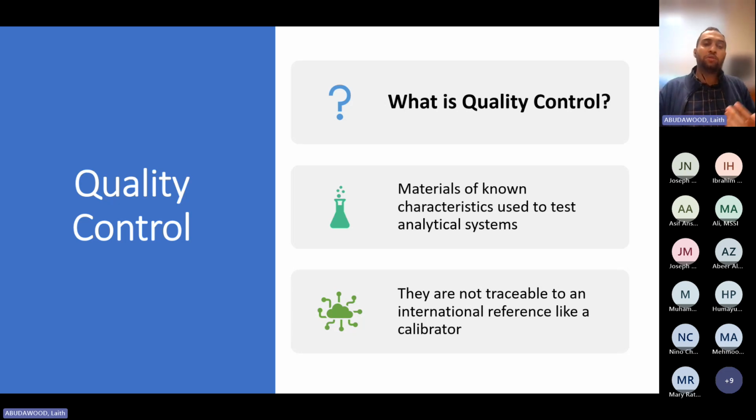Now, one important point: QCs, for example in a Stago case, are generally human plasma. It's plasma collected from donors. But we just said that we cannot use patient plasma. The difference between a QC that is sold to the customer and the patient plasma is this: when I take the plasma that I collected from donors, we take it to a QC department within Stago. The QC department runs this plasma on multiple analyzers, multiple Compact Maxes, multiple R Maxes, multiple Satellite Maxes. Then it sees what value each of these analyzers measured.